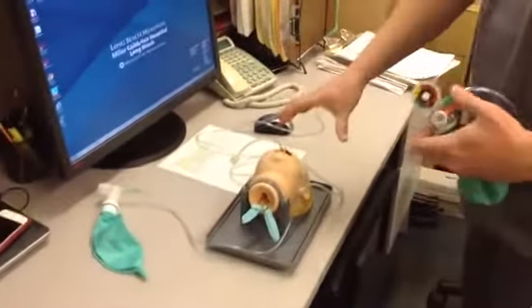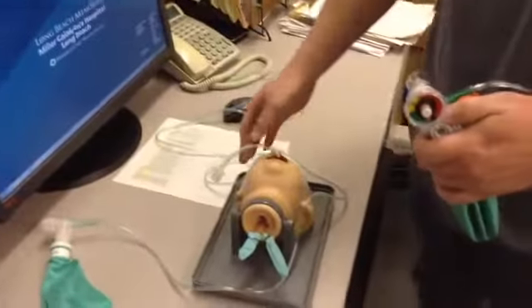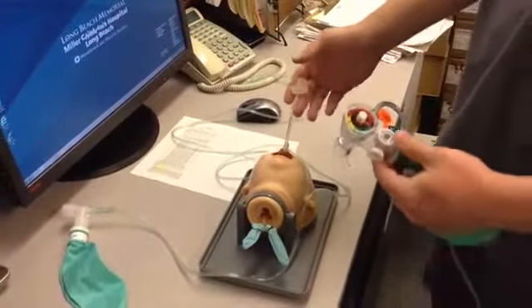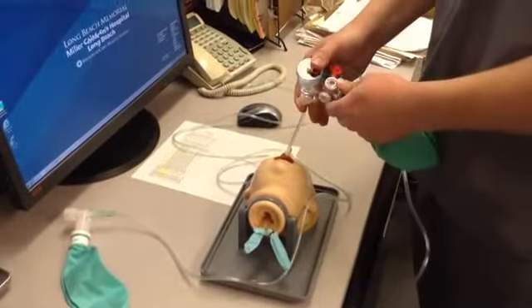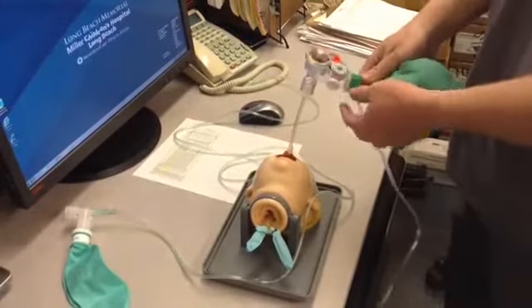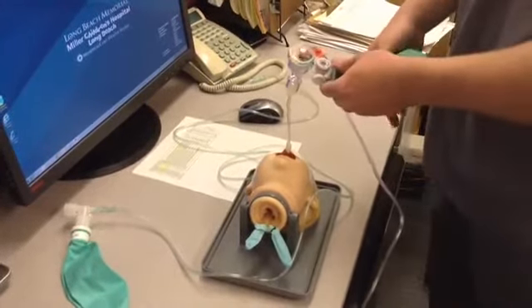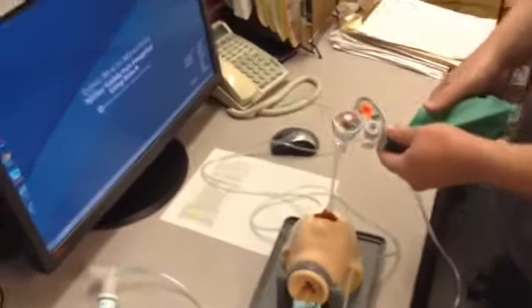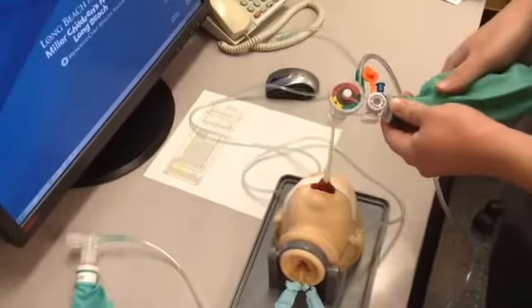So I have a dummy head here with an ET tube on it. So the next thing you would do after you have the pressures that you're looking for is you're just going to connect it up to the patient. And this is where you need to be especially careful, because the compliance on the patient is obviously going to be different than what it was with it butted up against your hand.